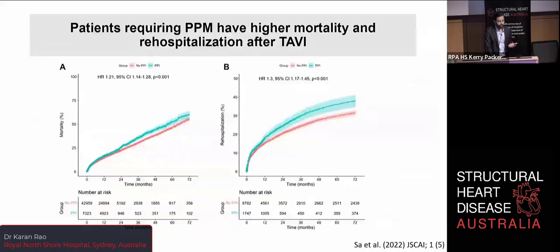So many people have suggested, hey, what about in high-risk patients? Why can't you just put in a pacemaker? Or why can't you put in a leadless pacemaker and then forget about the whole deal? Well, pacemakers are routine, but they're not necessarily benign. They increase the risk of dysynchrony, particularly single-chamber pacemakers. They increase mortality and rehospitalization as a result.